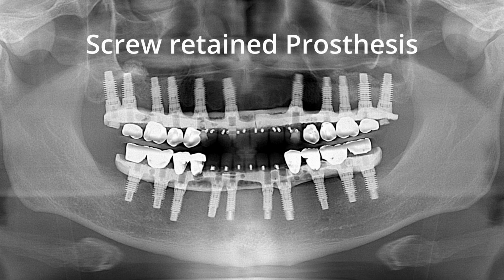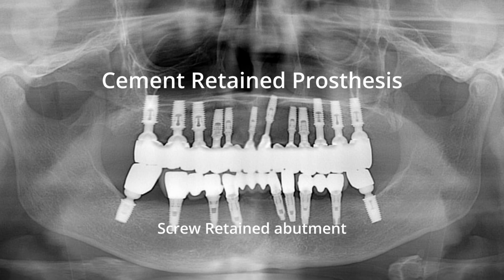In the early days of implant full-mouth rehabilitation, most prostheses were screw-retained, fully bone-anchored prostheses. It is also clinically feasible to fabricate screw-retained prostheses at the fixture level. Of course, fixtures must be placed with precise positioning and angulation to properly control the location of the retaining screw holes. In some cases, metal frameworks were fabricated at the fixture level to create fully bone-anchored prostheses. In this patient, metal capping was used for the premolar and molar regions, while porcelain denture teeth were used in the anterior region.